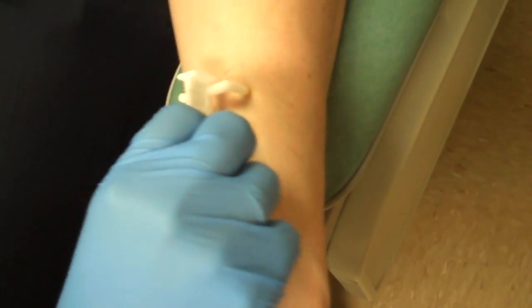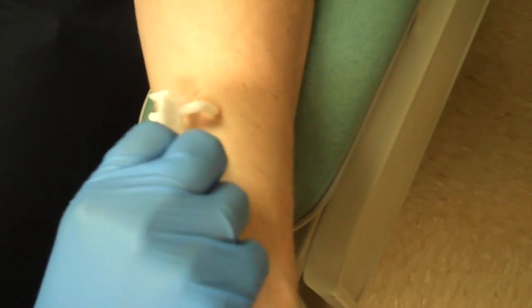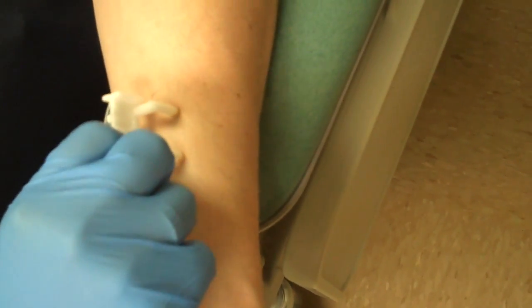We're going to time all of these allergens for about 20 minutes. At the end of the 20-minute mark, we'll get to read every single allergen on the skin.